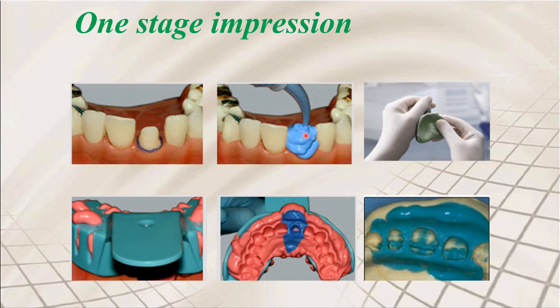After removing the gingival cord, drying the area, you place the impression — the light body is placed around the preparation, the putty is on the tray, and the tray is then seated properly and pressed to record the impression. You can see there is a putty and a light body, and together this forms the impression.